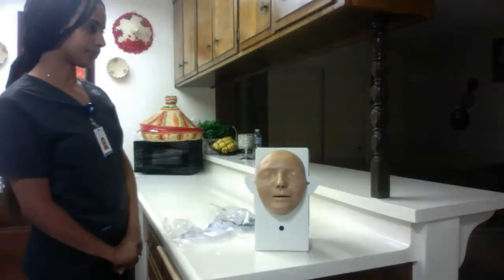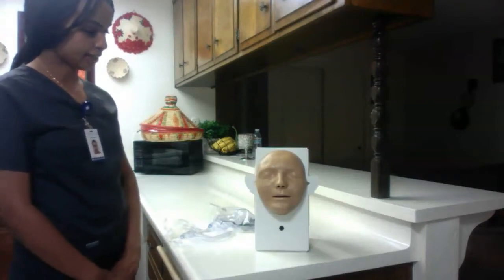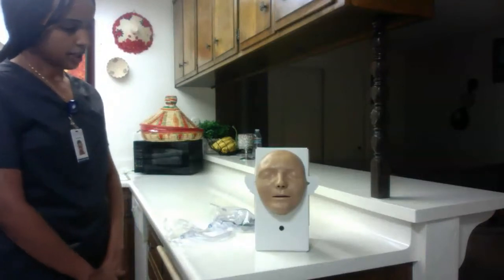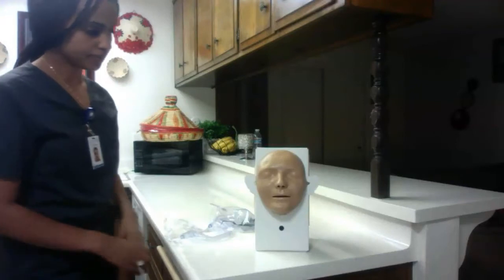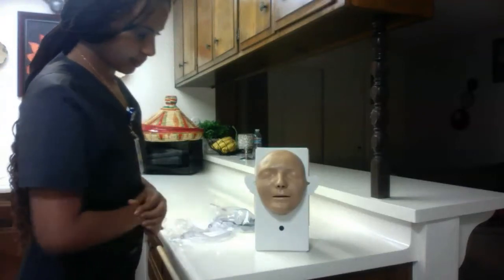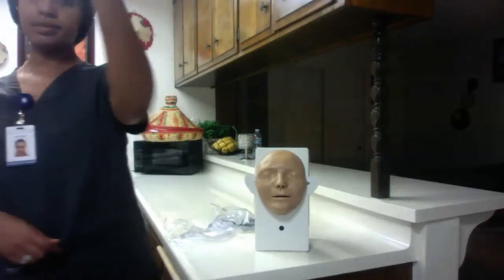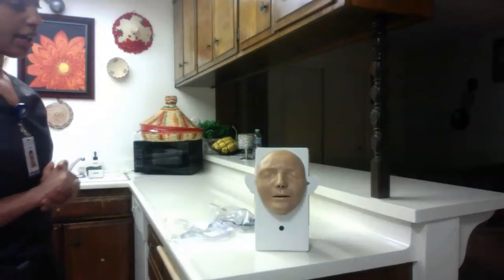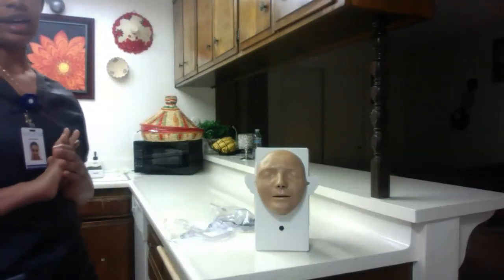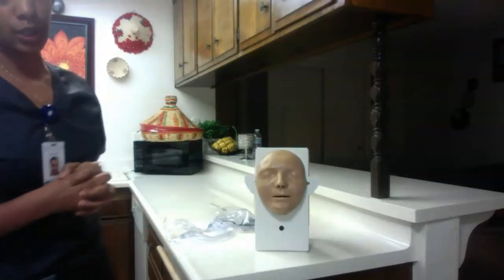Knock knock knock, may I come in? Yes. Hi, my name is Mahalit and I'll be your nurse today. May I please ask your name and your date of birth? Let me check your wristband. Thank you. I'm going to go ahead and provide privacy, wash my hands, and explain what I'm going to do — the procedure.